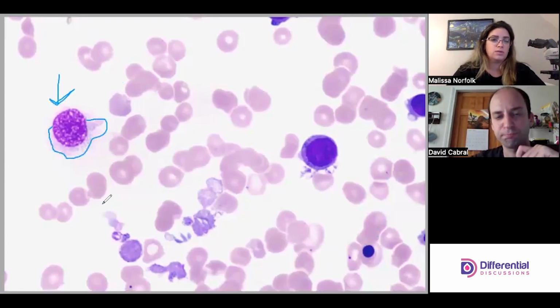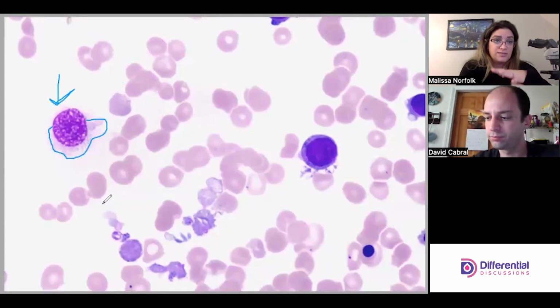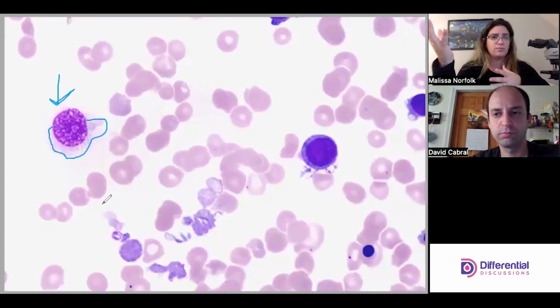And so, like Dave said, you'll see this when there's stress on the marrow. In this case, there's definitely stress on the marrow. There's this malignant process that's taken over the marrow, right? So if it's a regular straight AML, the malignant myelophthisic anemia that goes with AML, where the malignant cells have taken over the marrow and there's just no space for hematopoiesis, that puts pressure on whatever functional megakaryocytes you do have in the marrow.